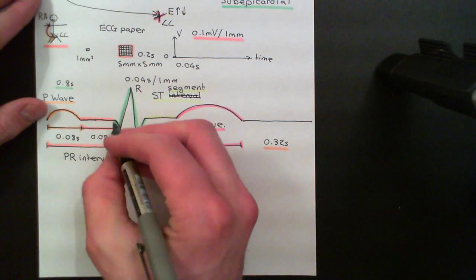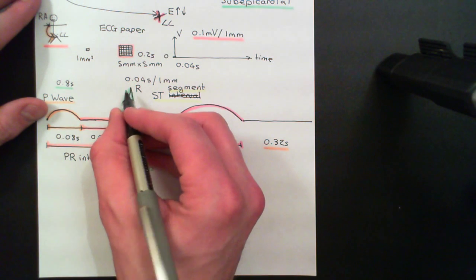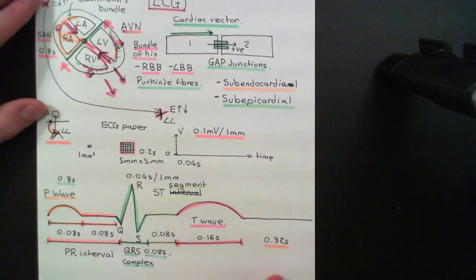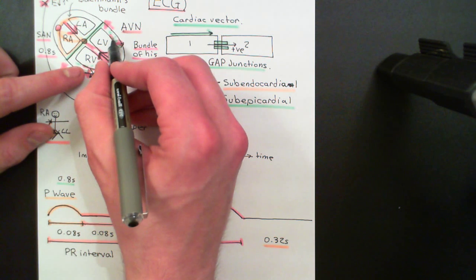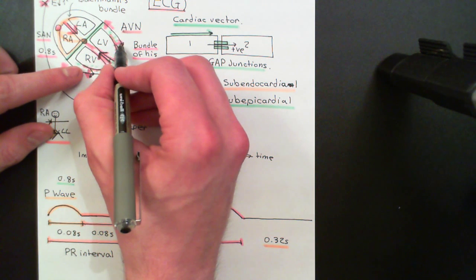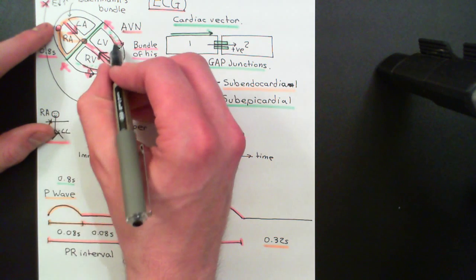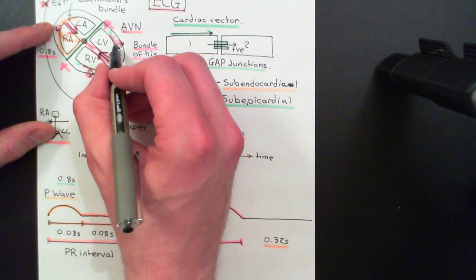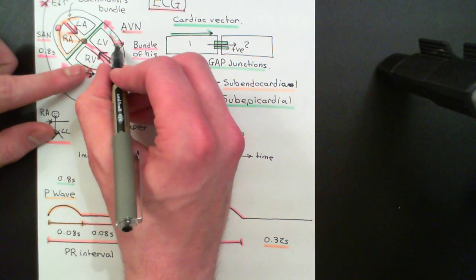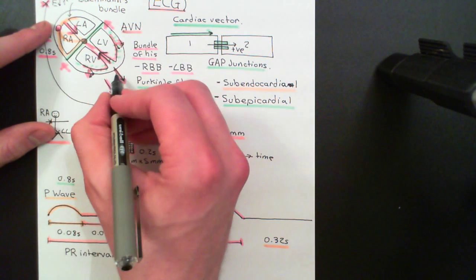Okay, now you can then obviously see the reversal of this a little bit, but really what this huge upward slant here is now major ventricular depolarization. Okay, so the R wave next. What's now going to happen is the ventricular conduction system is going to unleash the action potential onto the major portions of the ventricular muscle, all of this portion, the huge portions of the ventricular walls. And we know that it's released onto the inner myocardium, the subendocardial myocardium, and propagates out towards the subepicardial myocardium, the outer myocardium. And overall, the direction of current flow, the cardiac vector, is again downwards.